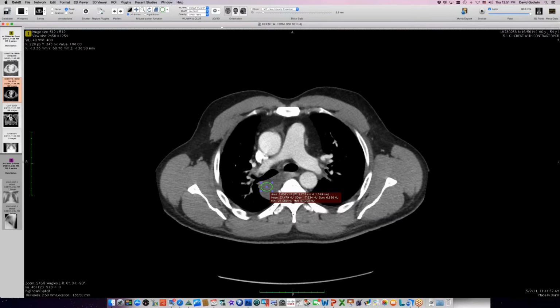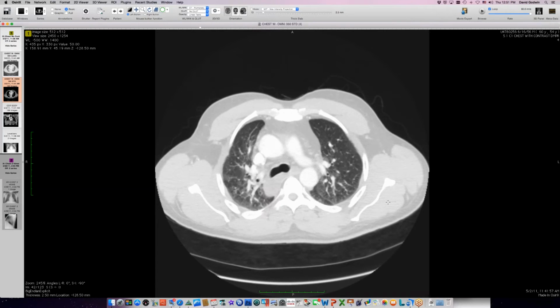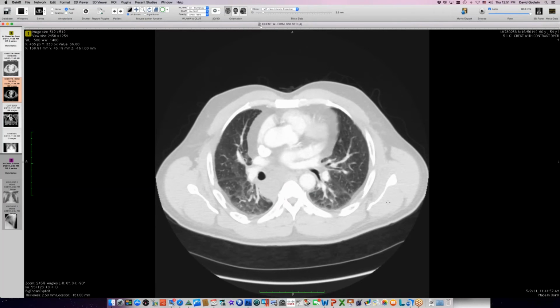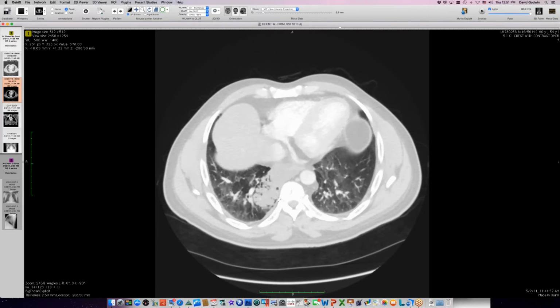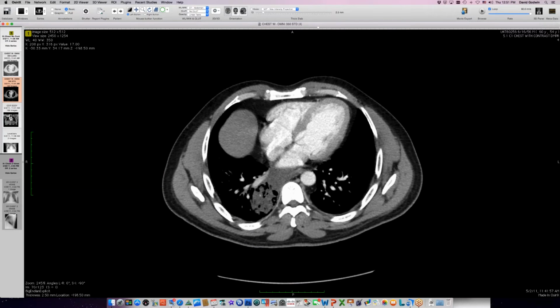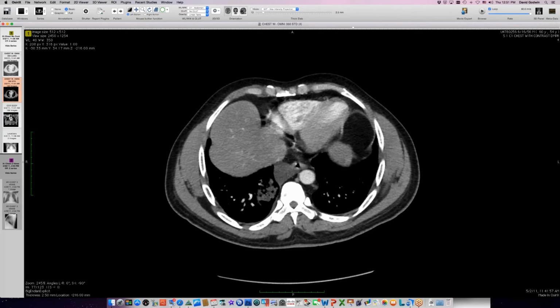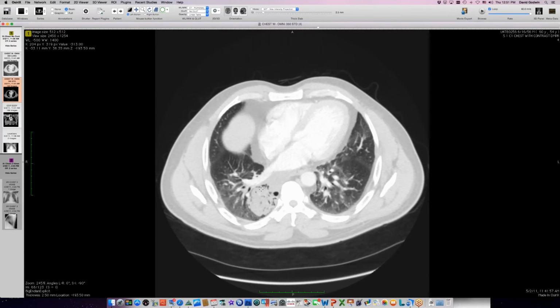So we've got 23, so that's nice and low. And I think that this is probably a cyst, a bronchogenic cyst. And then there's this lung lesion down here, this kind of balled up lung lesion that looks as if it's got some bizarre bronchi in it. I think these are bronchi and not just holes, but they're rather bizarre, and it's very, very contained like this.